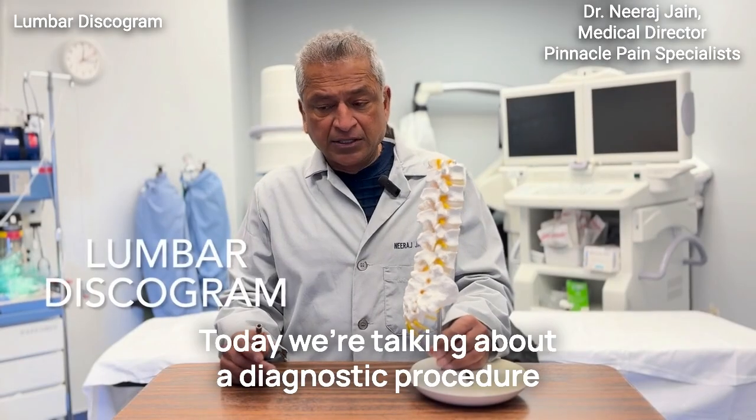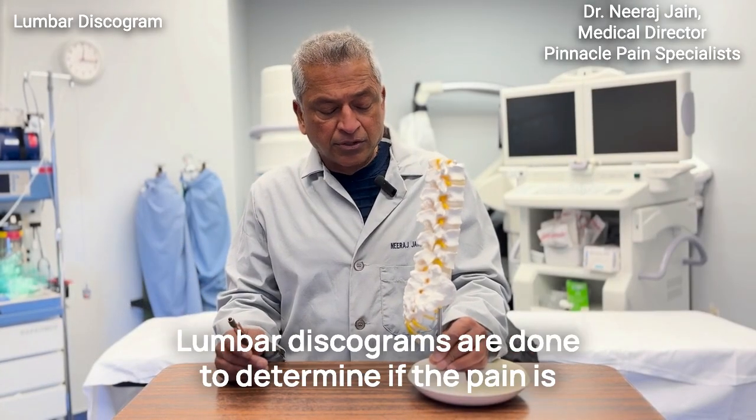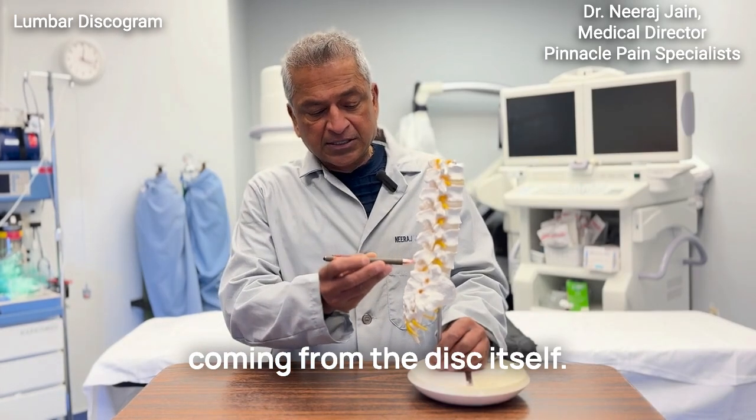Today we're talking about a diagnostic procedure called a lumbar discogram. Lumbar discograms are done to determine if the pain is coming from the disc itself.